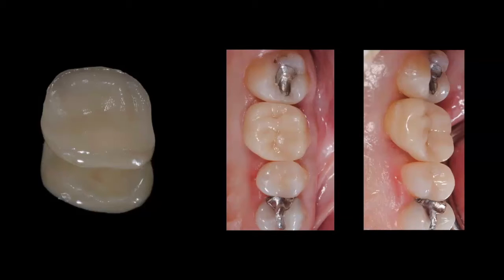So for this particular case, again, I did my trying before the etching, but you can also do your trying after the silanization. So after the entire procedure of cleaning and silanization of your restoration.